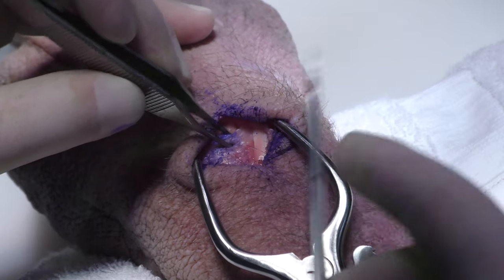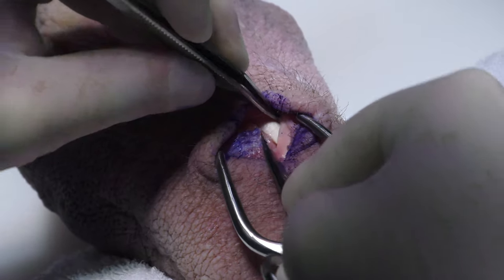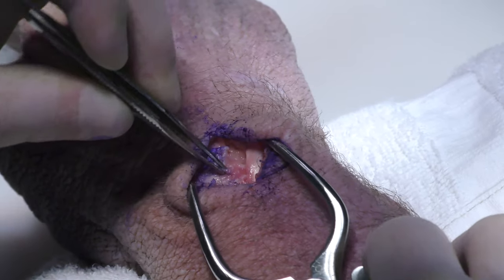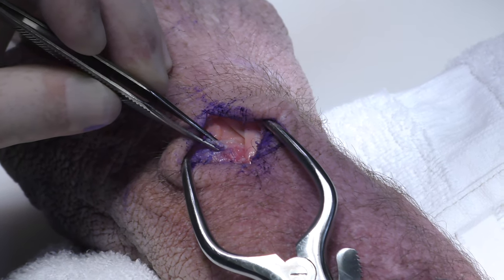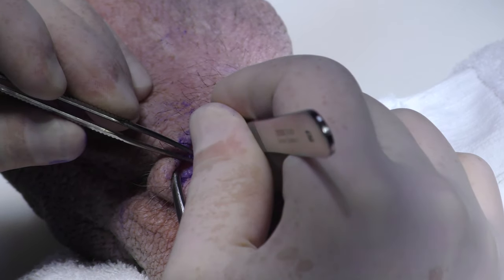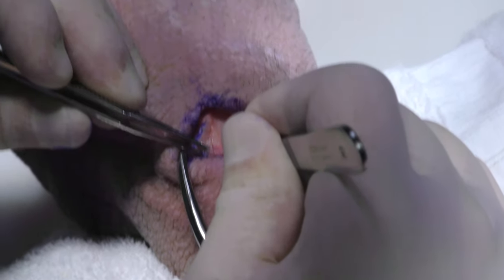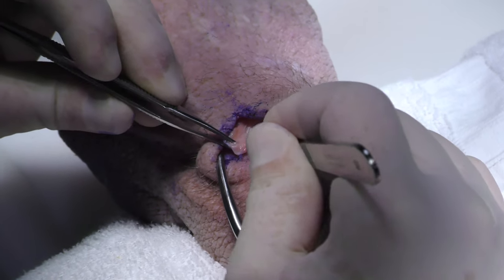And then, of course, the tendons that you can see right here are the second compartment tendons, or the radial wrist extensors. And so we're just distal. Here is Lister's tubercle, this bony prominence. Anatomically, if we make a capsulotomy right there, we should be right over the scapholunate interval. This is always something that you have to do carefully, because you obviously don't want to cut into the scapholunate ligament, and you don't want to cut your EPL tendon.